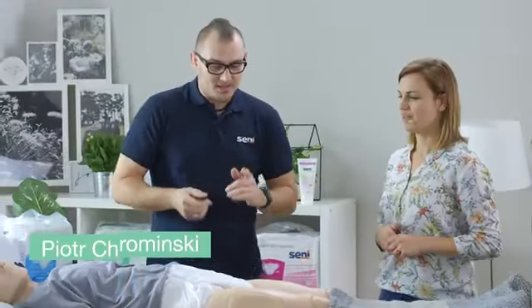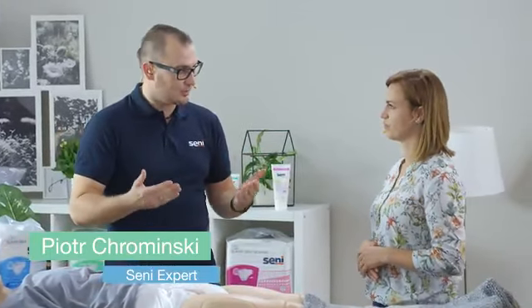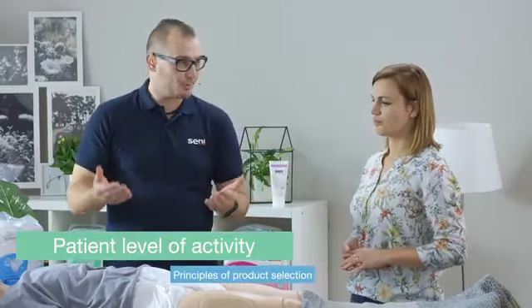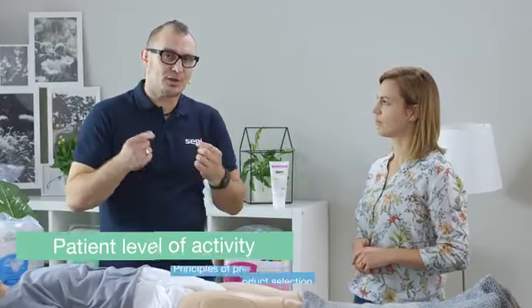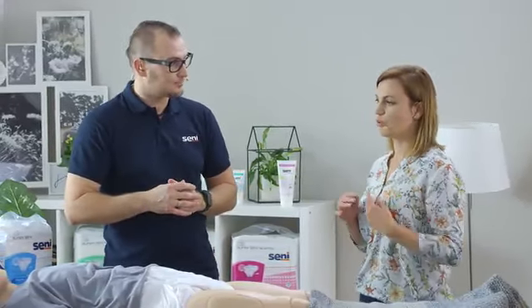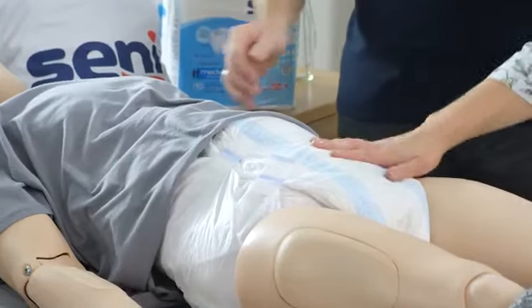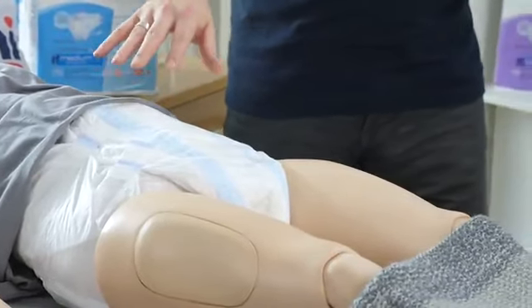Hi! The first thing to pay attention to when choosing an absorbent product is the level of activity of the person we provide care for. Is he or she a mobile person or not? Is he or she able to somehow use the toilet or toilet aids, at least partially? Maybe get up a few steps and use the toilet chair, or use a urine pot? So we have different products for mobile people and different ones for people in lying position, such as our friend Adam. Yes, our Adam is a lying person, and we would firstly suggest adult diapers for him.